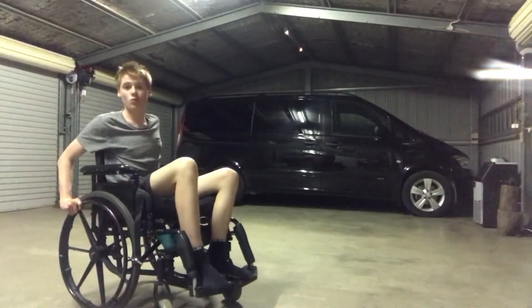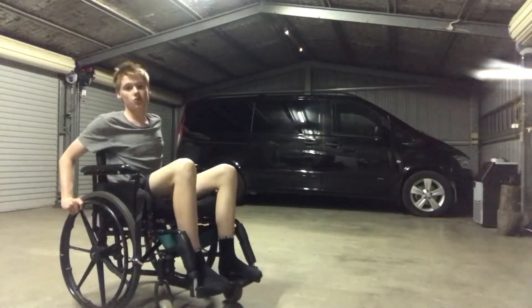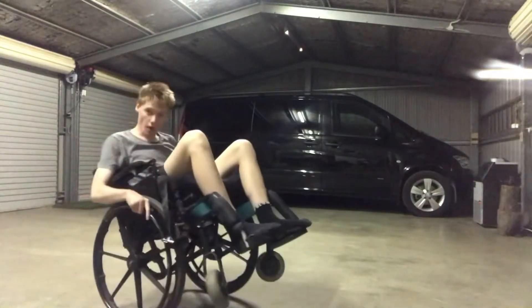Here's how to do a wheelie in just one minute on a wheelchair. To initiate the wheelie, you want to quickly roll up like that.